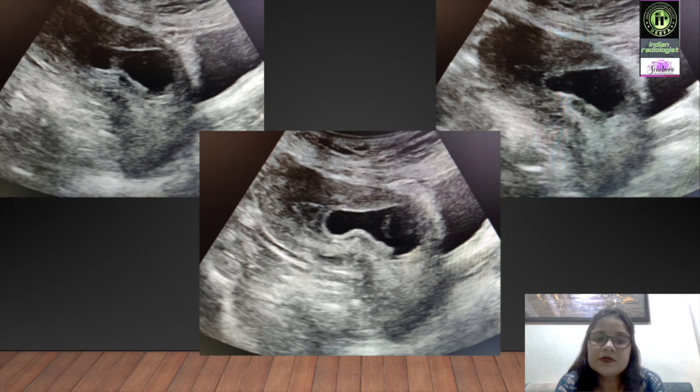Here we can sometimes find the endometrial cavity, which is empty, but it is filled with slight fluid collection we can find here. And definitely the sac here is bulging and occupying more than half of the anterior corpus, with thinning of the anterior myometrium and even more thinning as we follow it up.